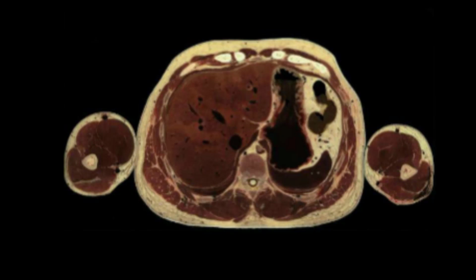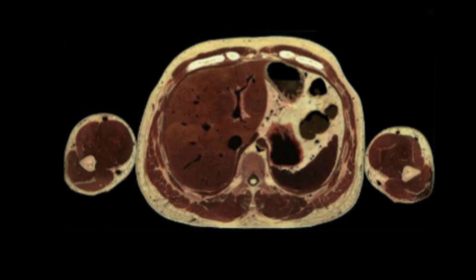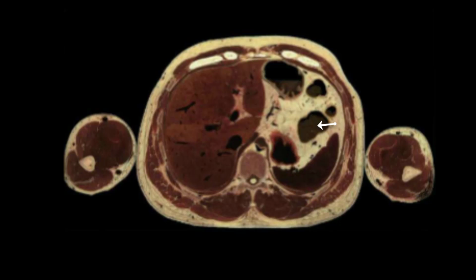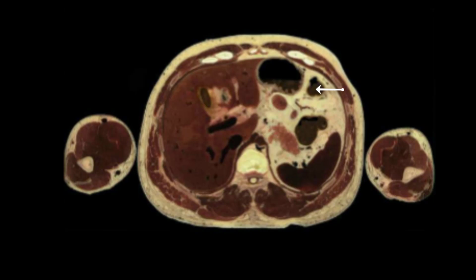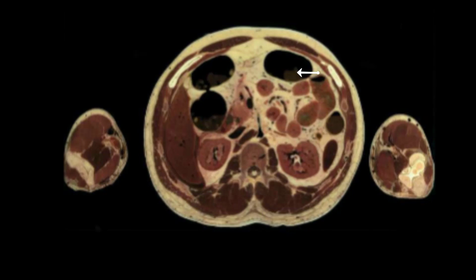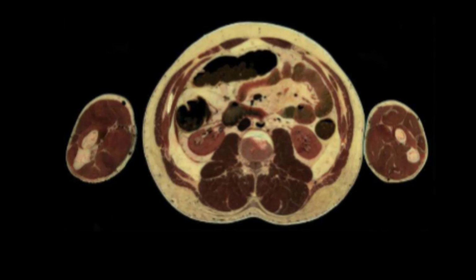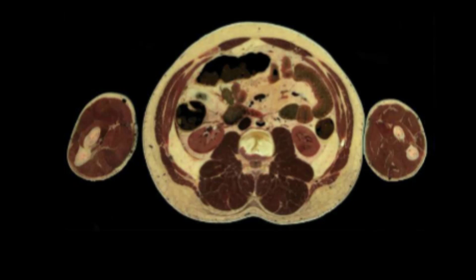The anterior part of this flexure continues with the transverse colon, while the posterior part, now you see it here clearly, becomes the descending colon and it descends down to continue with the sigmoid. Well, now please focus on the transverse colon, and you're going to see how it moves from the left side to the right and finally joins the counterpart from the right side.